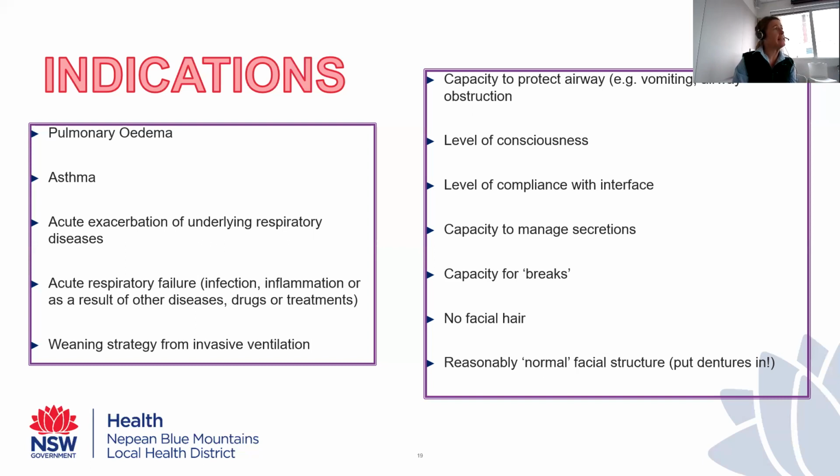However, I guess in this context, it means if you have a patient who's developmentally delayed, if you have a patient who's profoundly claustrophobic, if you have a patient who has maybe some mild dementia, they might not actually have the skills or the ability to tolerate the mask being put on their face because, one, of the level of understanding, or two, in the case of claustrophobia, it's actually going to exacerbate their symptoms and they just can't tolerate it.